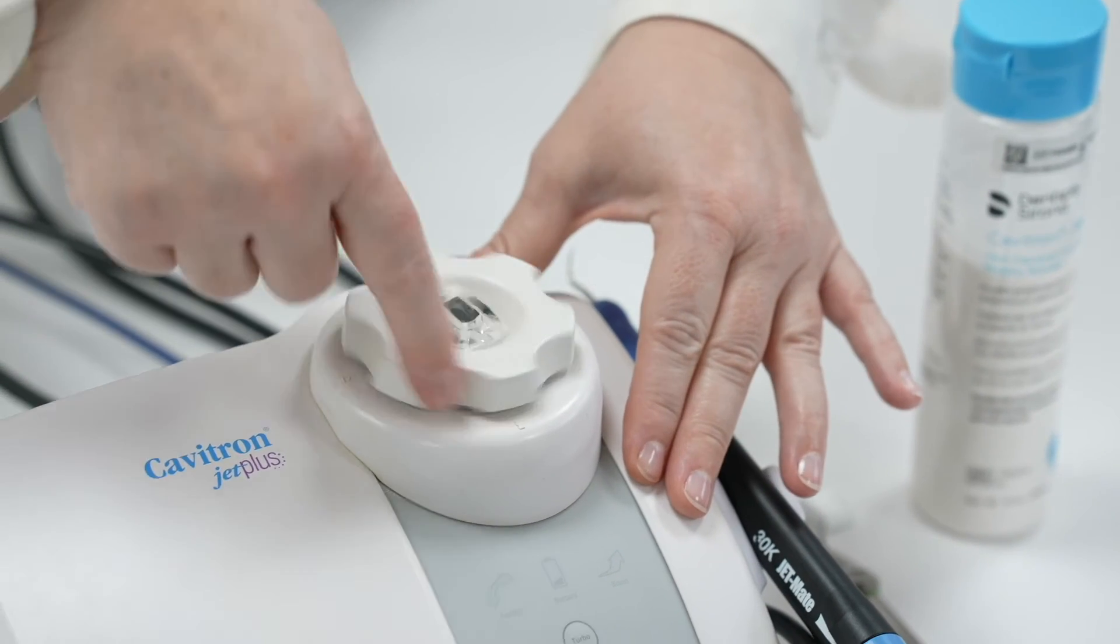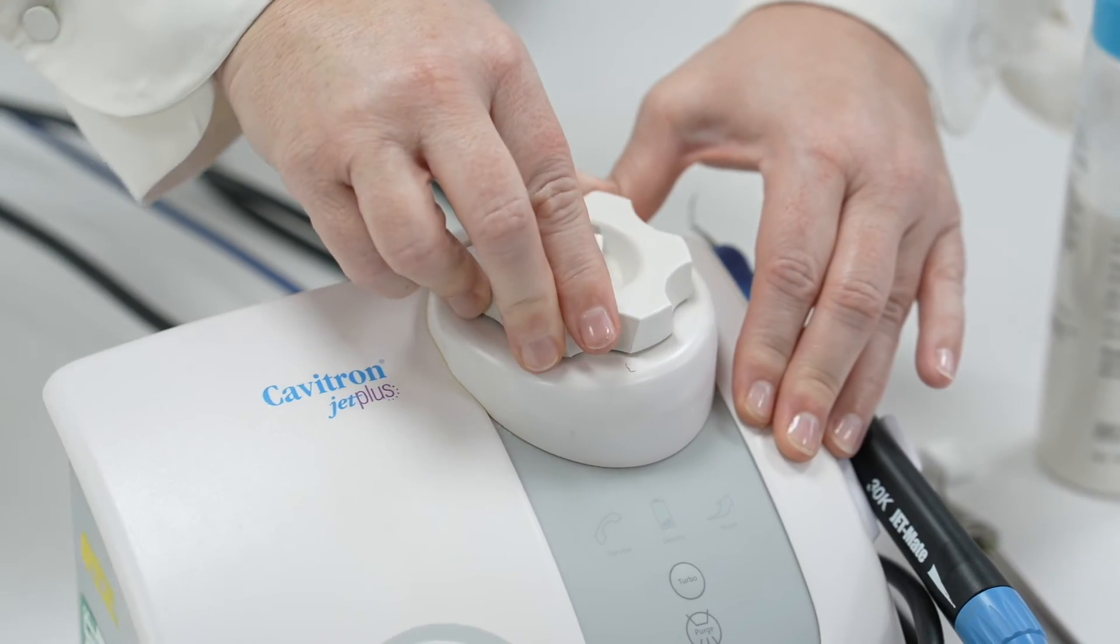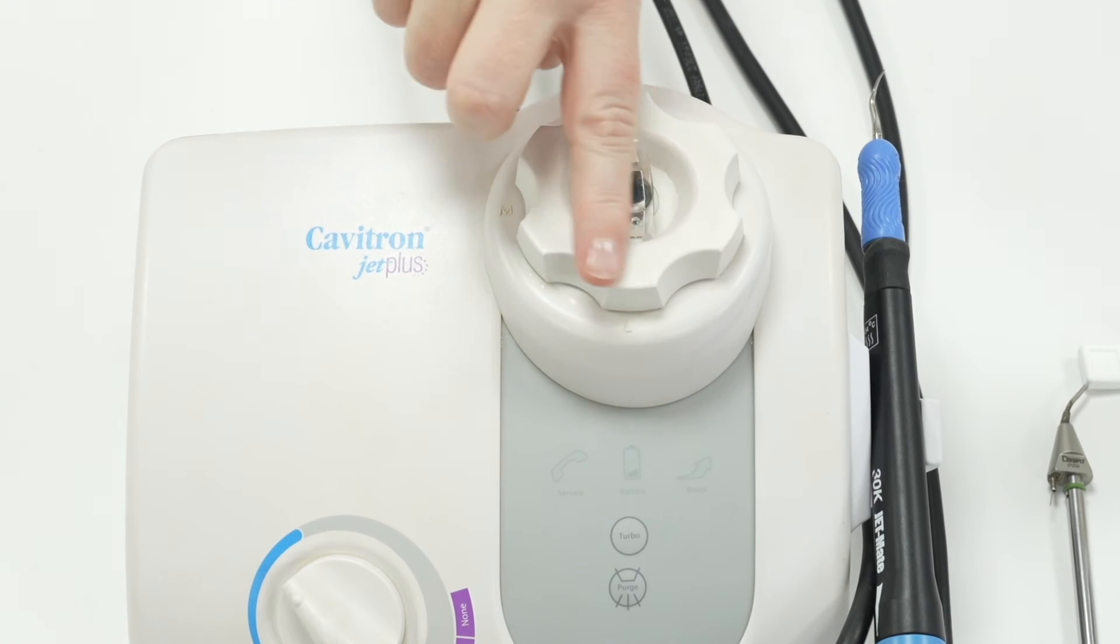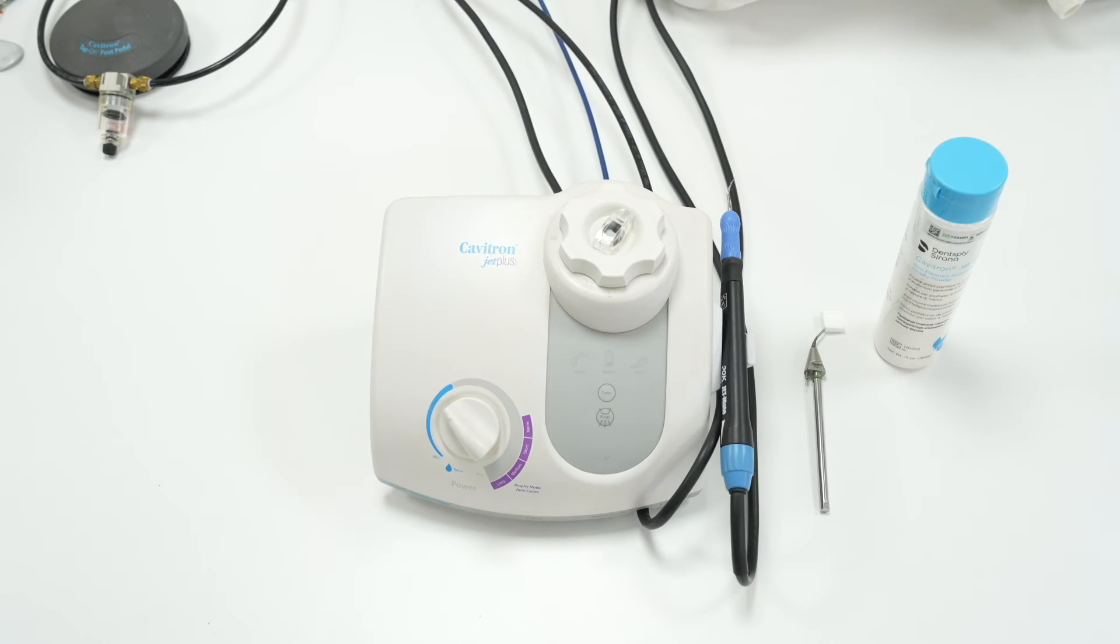Once the powder pot has been filled with powder and the lid is on tight, switch the Cavitron Jet Plus on to pressurise the system. The dial on the top of the powder pot indicates how much powder you'd like to come through the system. This dial should be checked before every use and should be set between low and medium, because when you re-tighten the lid you can sometimes accidentally move the dial.